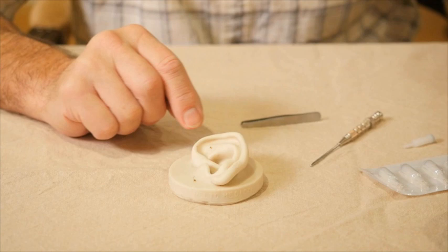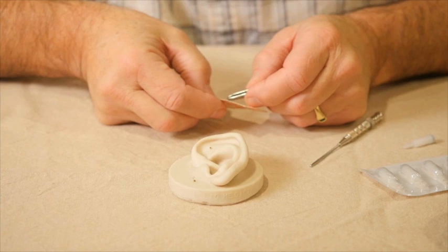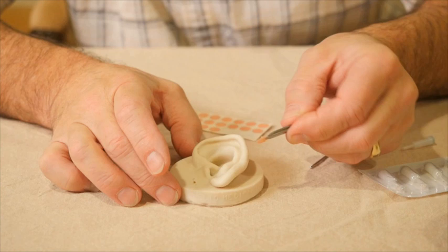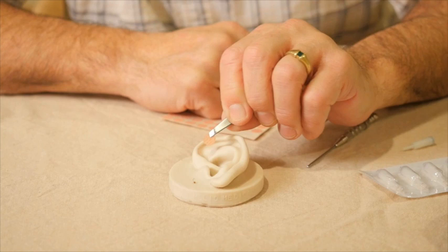Once ASP needles are inserted, a piece of tape or plaster is placed over the area to keep it clean and hold the needle in place. When removing, take off the tape — as often happens, the needle will come out along with it. If not, it's simply a matter of using forceps or a fingernail to scrape it out.